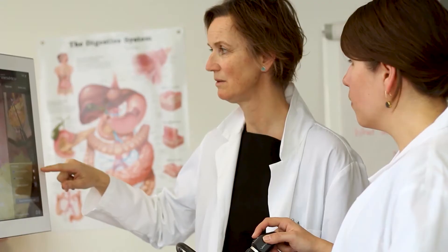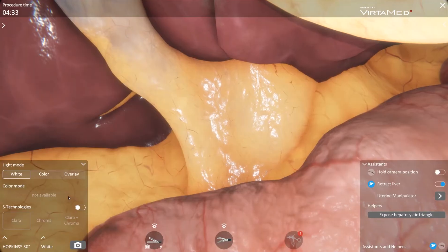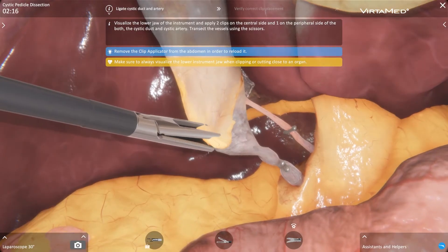Everything is integrated, so really when you train or simulate an operation, it's not just the technical part — it's all the steps before that. And then obviously it's also the practical part: the step-by-step learning and the introduction of different levels.